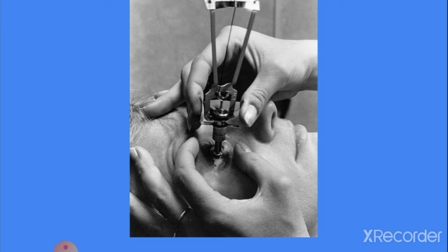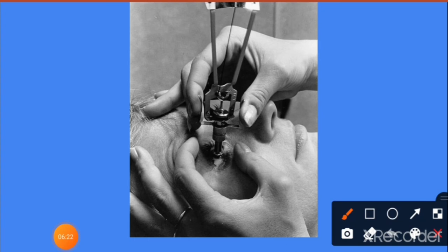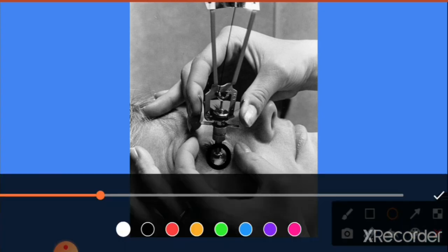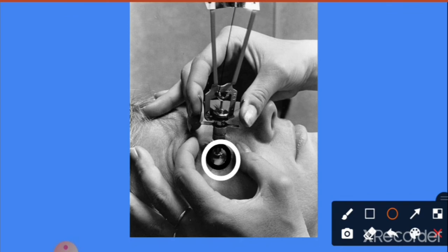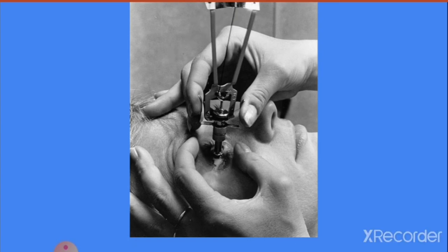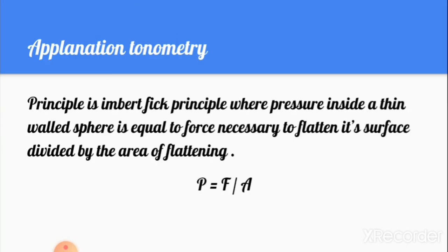Here is the procedure for measuring IOP using indentation tonometry with the Schiotz tonometer. You can see the footplate being placed on the eye. The needle moves and how much it moves indicates the IOP.